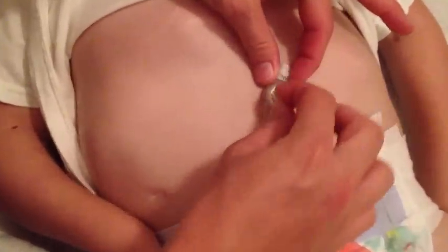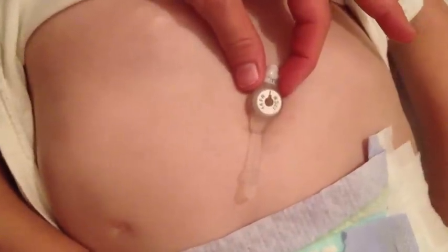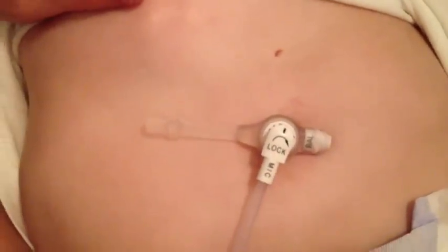First, we're going to take the white tube and connect it into his port. Open it up — there's a little plastic tip — and line up the two black lines. It'll snap in, then twist it to lock it. A quarter turn, half turn, or full turn is good enough.